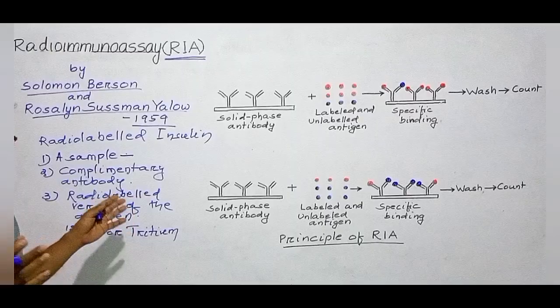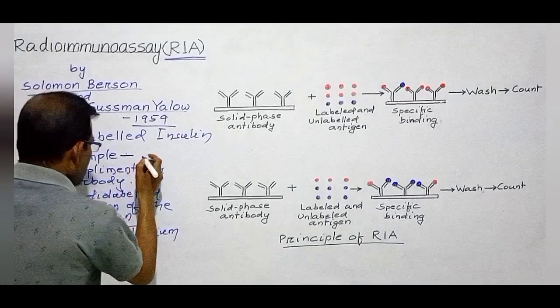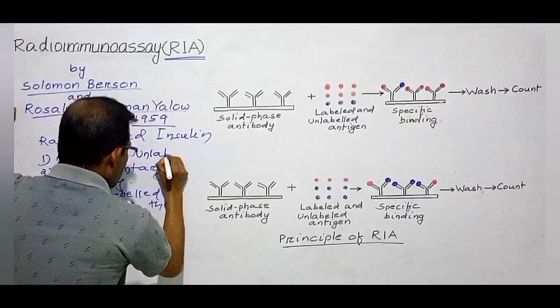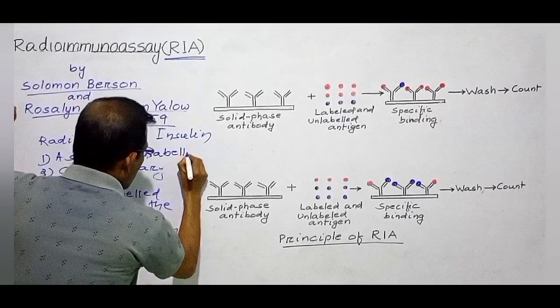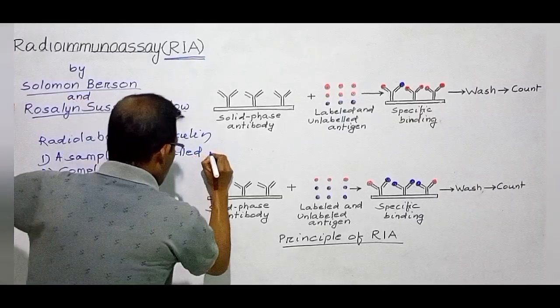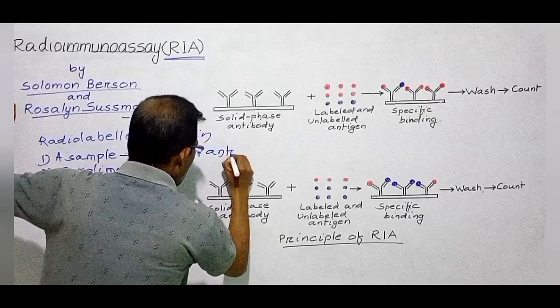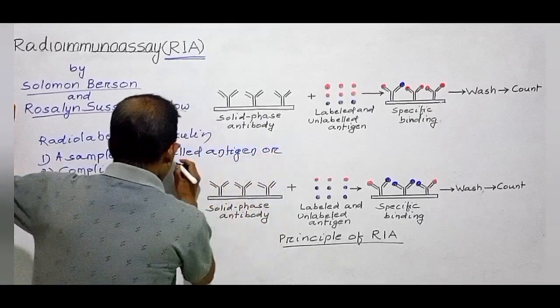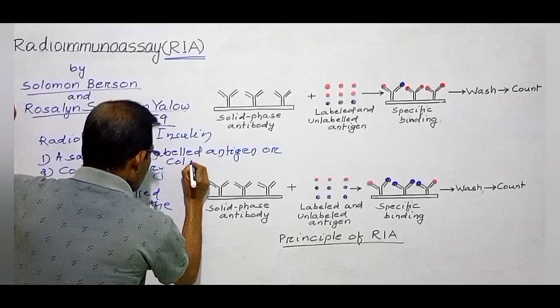The antigen present in the sample is known as unlabeled antigen, which is also known as cold antigen.